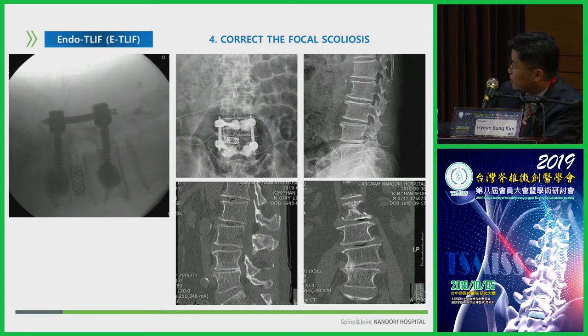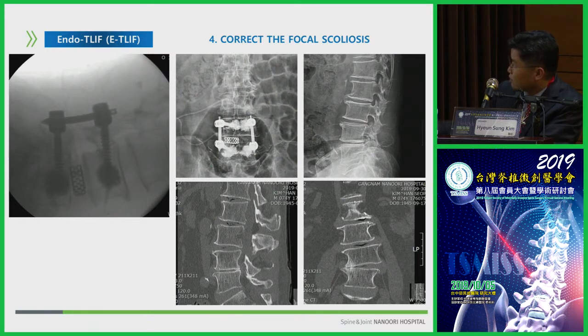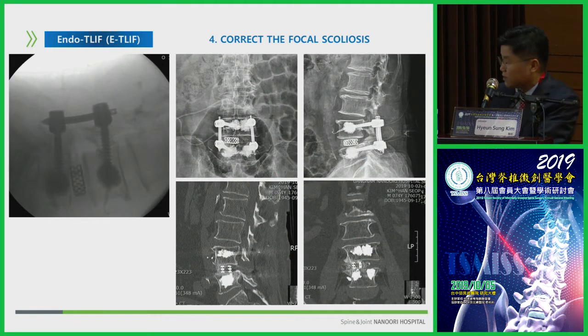Because of that, you can see here a severe lateral wedging state, but the correction is very easy. And you can see here another correction. In this same patient, you can see the correction is very good.